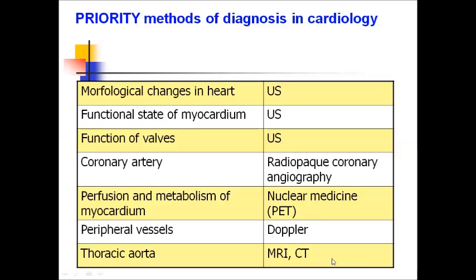If we need to concentrate predominantly on the anatomy of an organ, we will choose CT or MRI. If we are confronting moving structures, for example, blood flow in peripheral vessels or moving heart valves, we will use ultrasound with Doppler function.